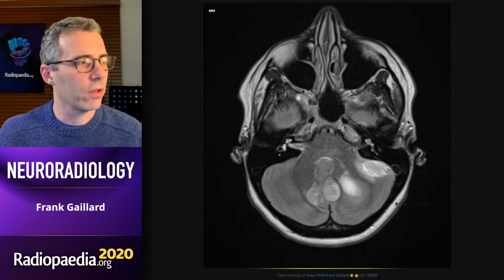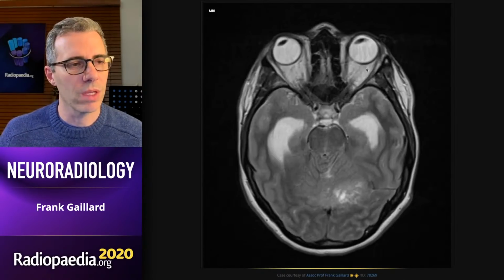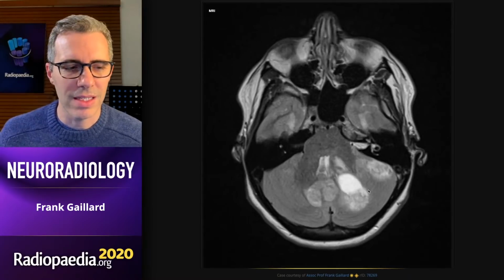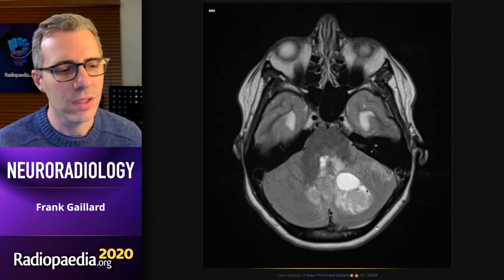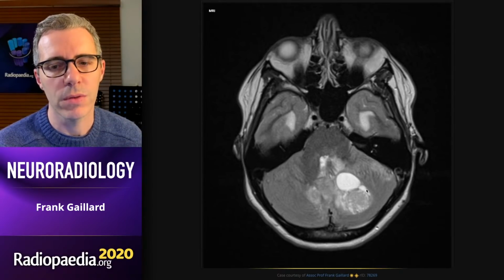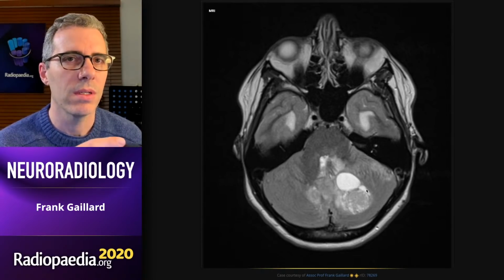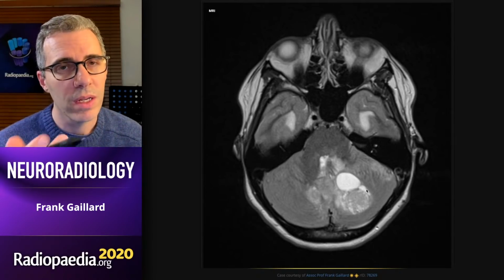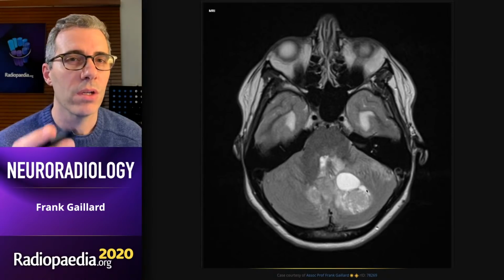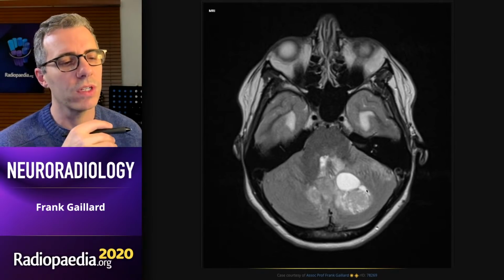You'd want to quickly have a look at the retinas to see if there's any retinal angiomas that would make the diagnosis. But the thing that stands against this being hemangioblastomas is that these are quite large lesions, but we're not seeing any flow voids from abnormal vessels. And by the time you get to this size, usually hemangioblastomas will have really prominent flow voids seen best on T2. More importantly, neither pilocytic nor hemangioblastomas would be expected to have this degree of ADC suppression or reduction.